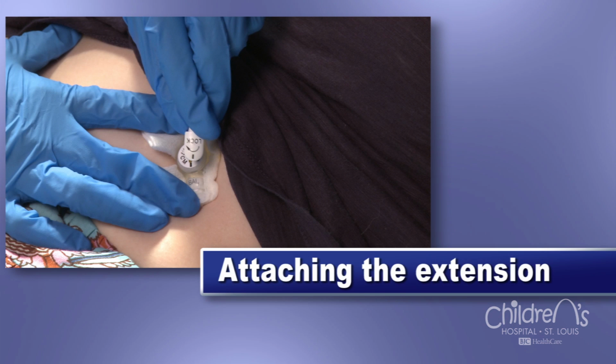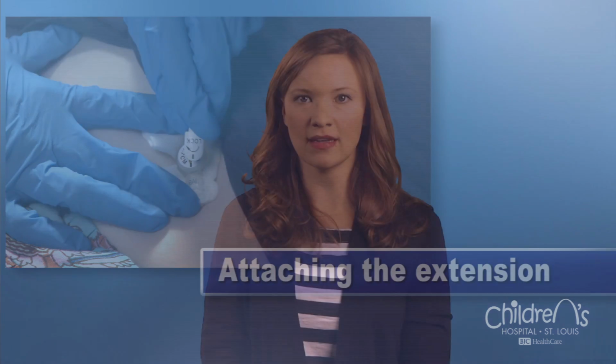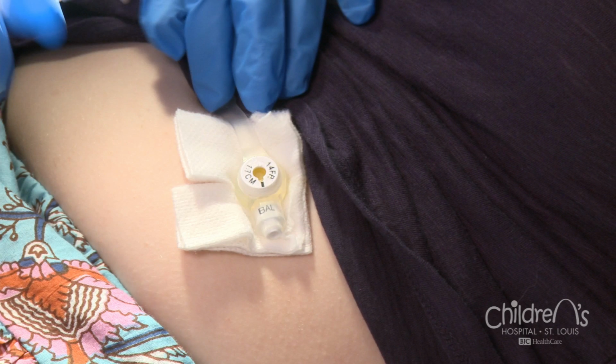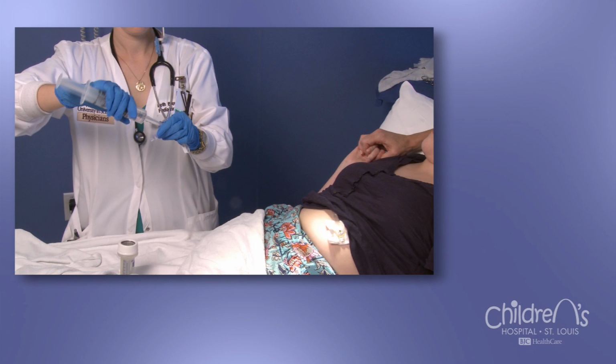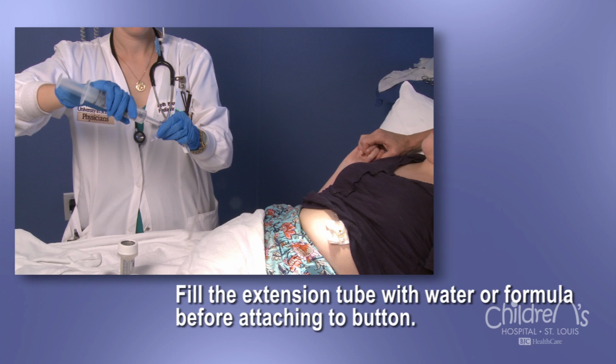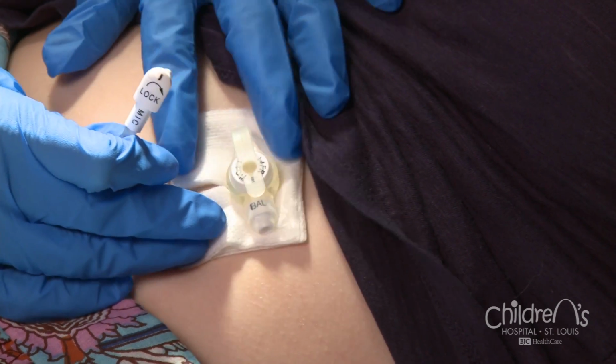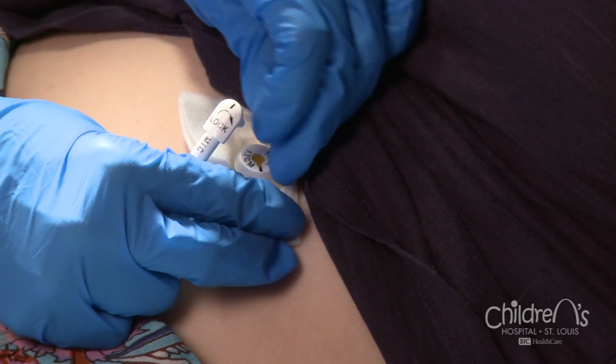In order to give feedings, medications, or water through the button, you will need to know how to attach the extension tubing to the button. Since the button has a one-way valve, feedings should not leak out when the plug or tab is open. Here are steps for connecting the extension tubing. Fill the extension set with water or formula prior to attaching it to the button. This prevents inserting air into your child's stomach. Lift the plug or tab out of the button.